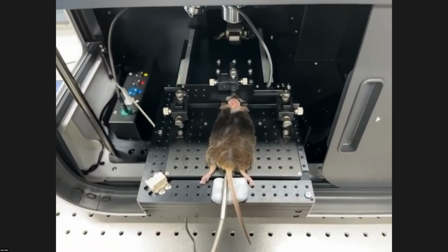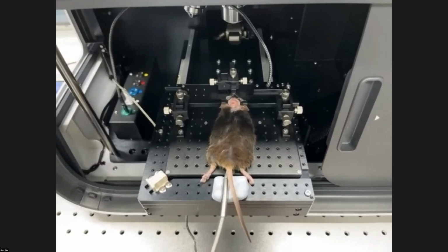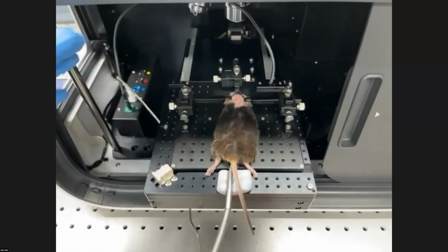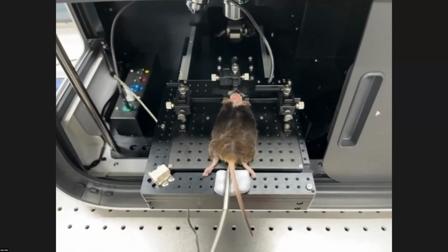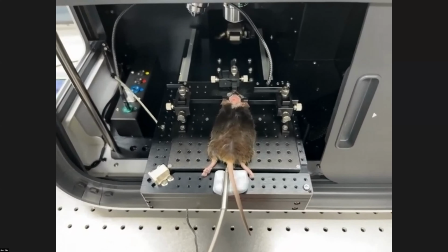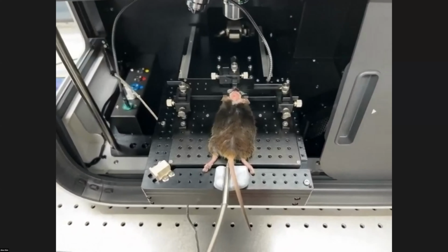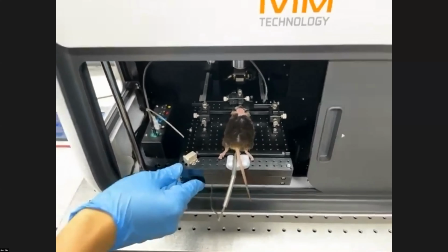As for the surgery procedure of cranial imaging window implantation, I will put it briefly. After an incision of the skin and getting rid of some of the connective tissue right on top of the skull and doing a bit of drilling, the circular cranial bone fragment, whose diameter is 3 millimeters, would be replaced with a round cover glass of the same diameter. And the other exposed skull would be molded with pink dental cement. And to start the imaging, I will slide the animal stage inside the imaging room.